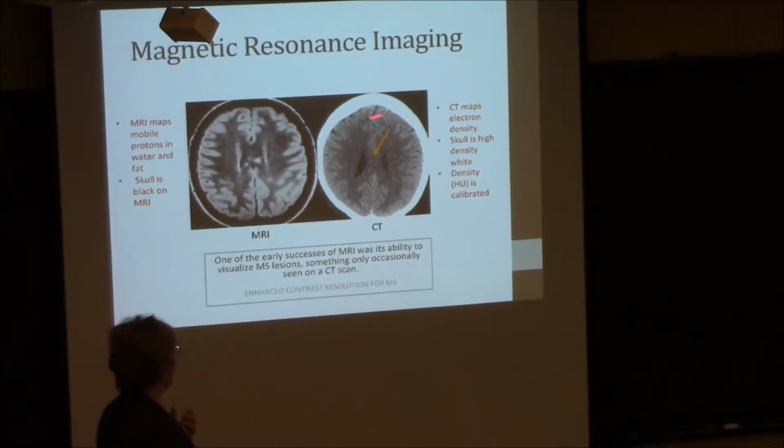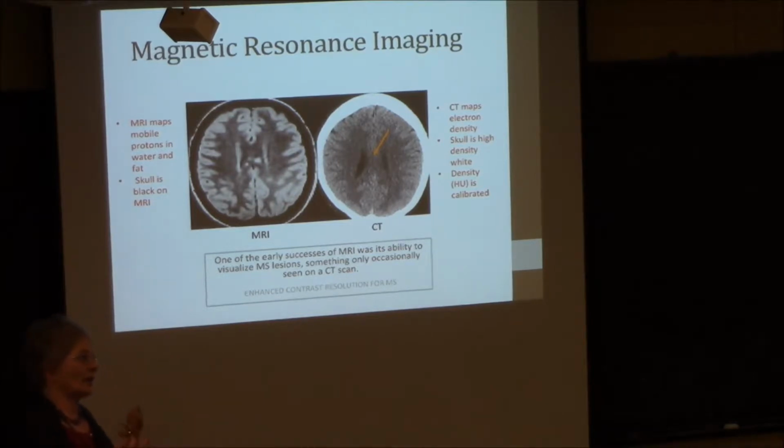And so they would do CTs, and every once in a while for an MS patient, maybe when they got a new lesion, you would actually see it on the image. But for the most part, it was kind of a benign image, and you could only guess, and hope you hit the right time. But then MR came out, and these lesions were just incredibly visible on MR. And it was overnight that MS patients got MRs instead of CTs. But that's just a perfect example.